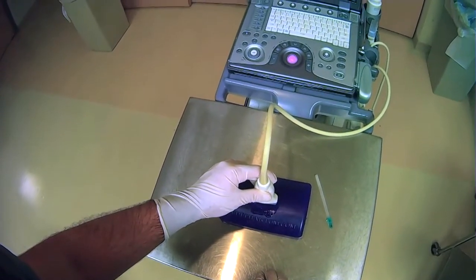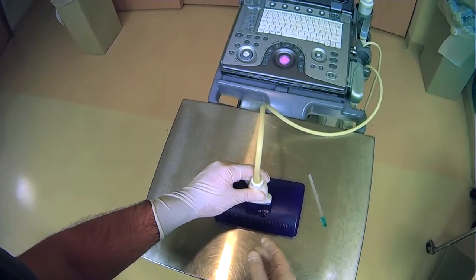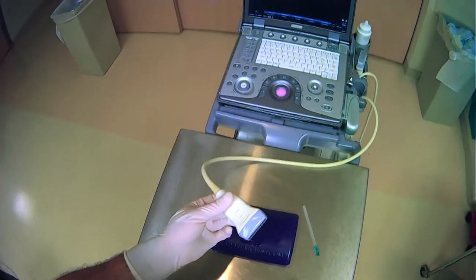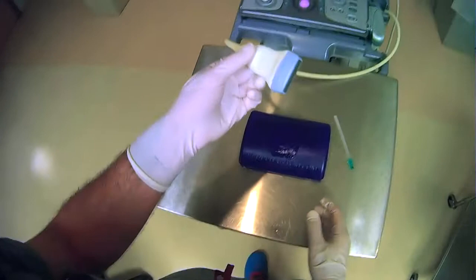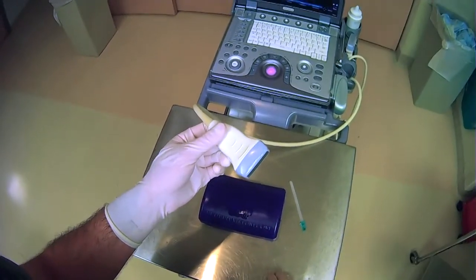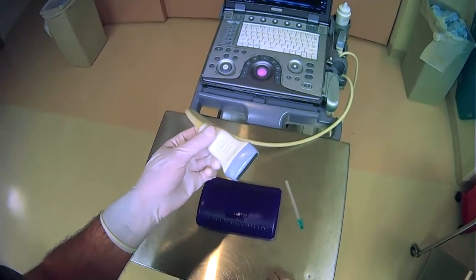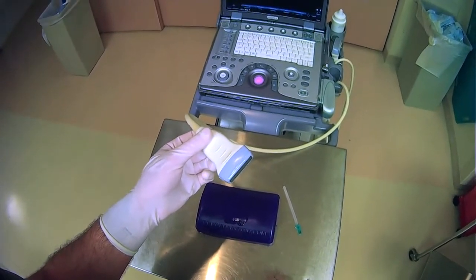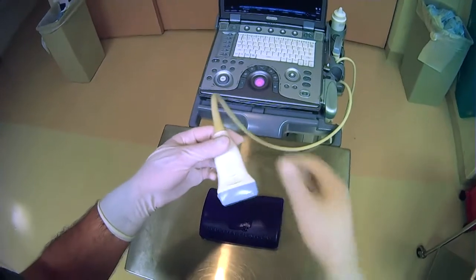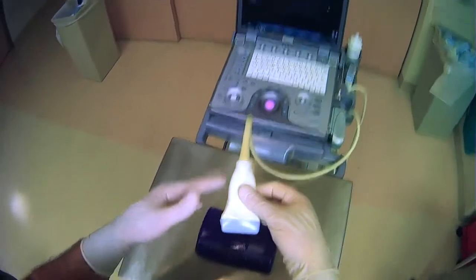So anytime you start an ultrasound procedure or really you start grabbing the ultrasound probe, you want to make sure that you're grabbing it in such a way that you will be very stable and your hand won't hurt or get tired after a little bit of time.